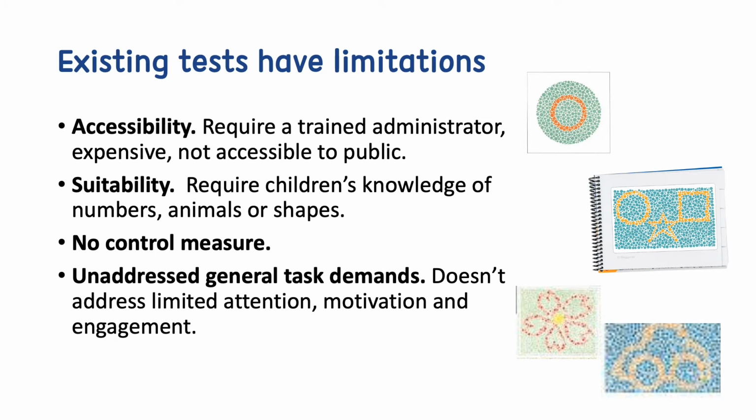So if you've ever worked with children, you know that they have limited attention, they need motivation to increase engagement with tests, and a lot of these tests don't actually take this into account.